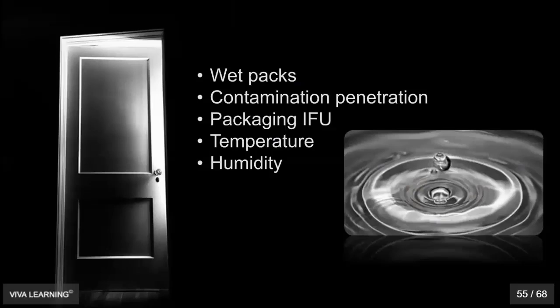All right, wet packs. When we said we were going to talk about dry in a little bit, wet packs are a major concern that I think sometimes we tend to just accept, that it sometimes happens. Wet packs must not be touched. Wet packs have to be fully dried before we can remove them from the sterilizer. We can't take them out of the sterilizer and put them on the countertop to dry.